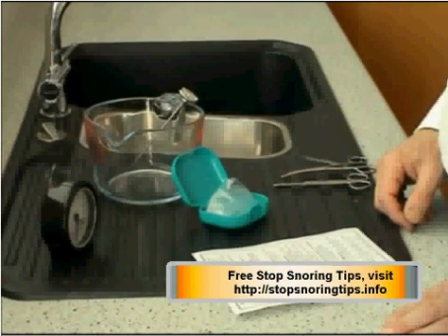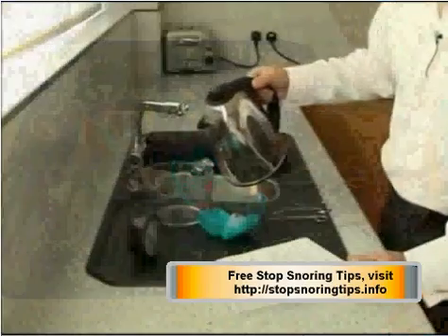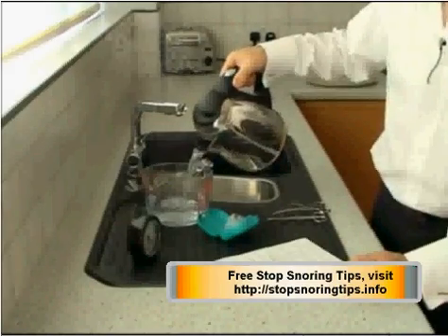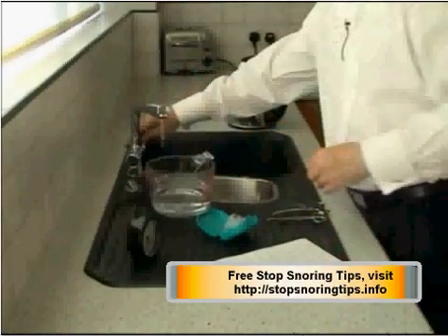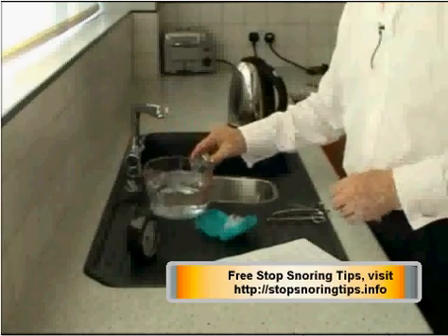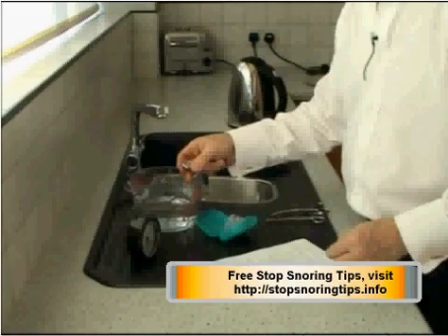The first thing to do is boil a kettle. So if we put 2 cups of boiling water into the jug and 1 of cold water, that should be about 65°C, give or take, which it is.